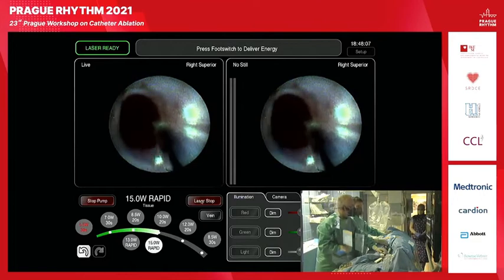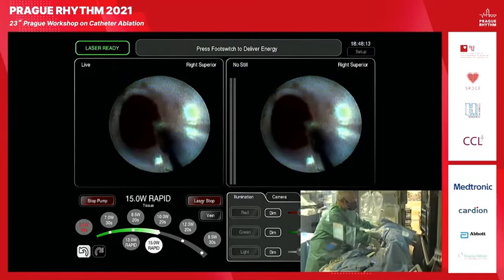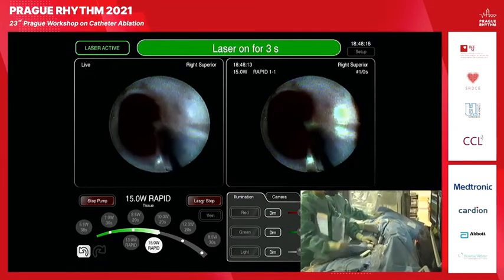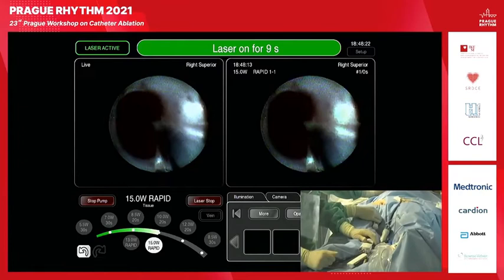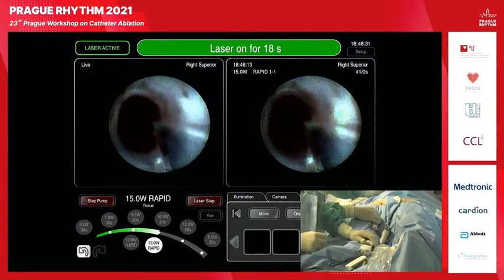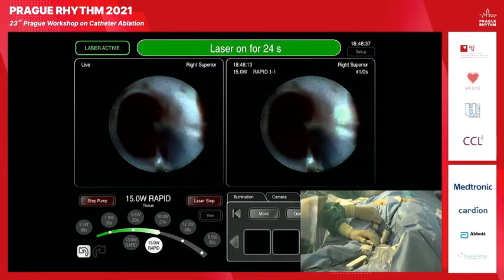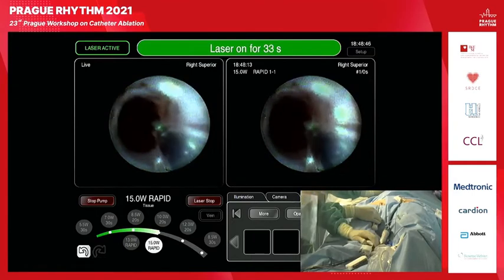So actually I will start right in the rotation, and you will see right now the starting point. Okay, so start the application. The laser is on, so the table indicates clearly the seconds I'm applying, and you can see that timing and the laser beam. On the right side veins, you can sometimes even visualize the blanching under the beam. In any single spot, you apply for, for example, 2 seconds. And the rotation of the beam is very nice.